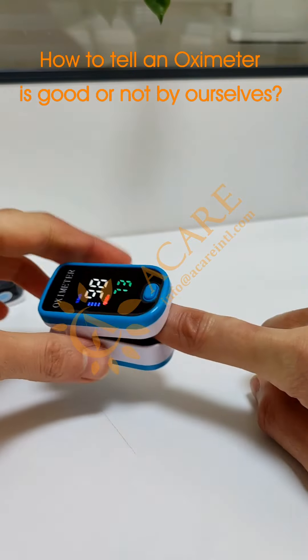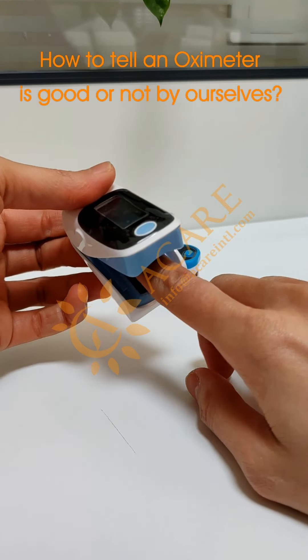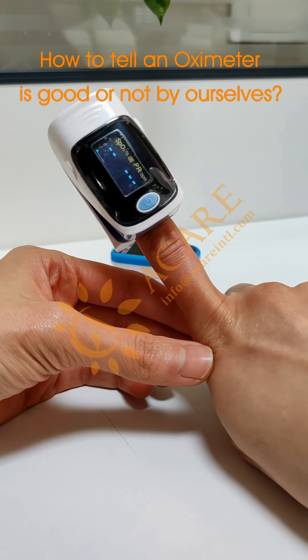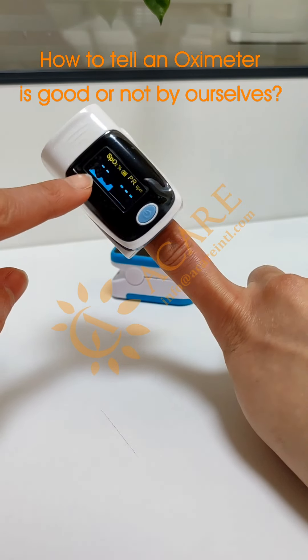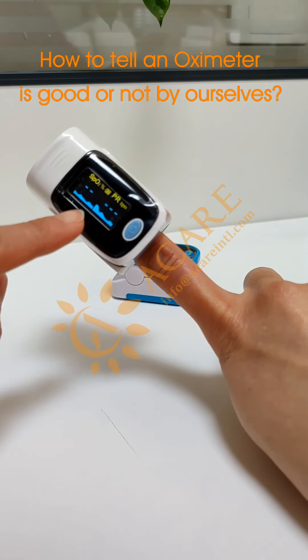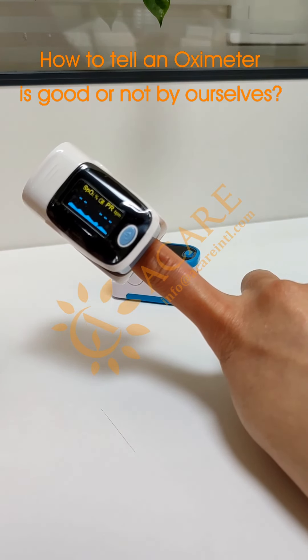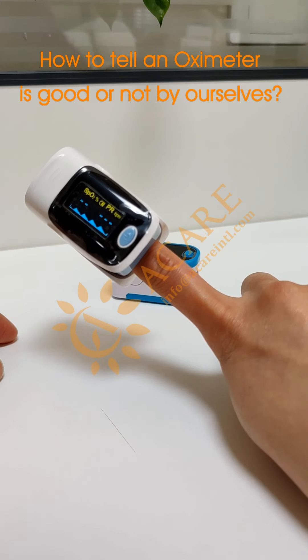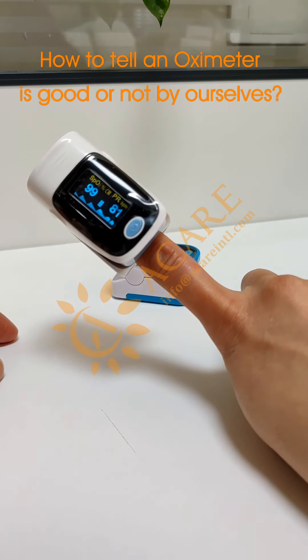Let's try the other one. Put my finger in and click the open button. You can see from the bottom there are some waves, and actually it is representing my pulse rate. So the reading is out.